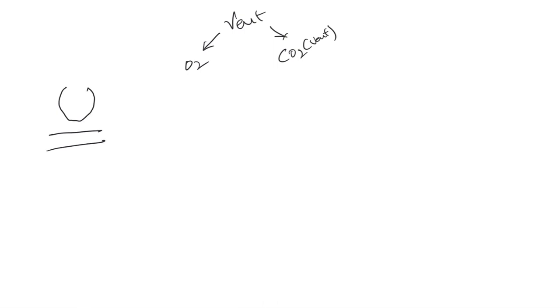Today we are going to divide the ventilator part into oxygenation and ventilation. These are the two main components. Whenever you think of the vent, think on two terms, oxygen and carbon dioxide, which is the ventilatory part. For oxygenation, the basic requirement is to have an alveolus that is open. It means it's filled with gas and blood flowing on the other side. That's all that's needed. In a normal individual, your oxygen enters at 75% from the right side and leaves at 100%.